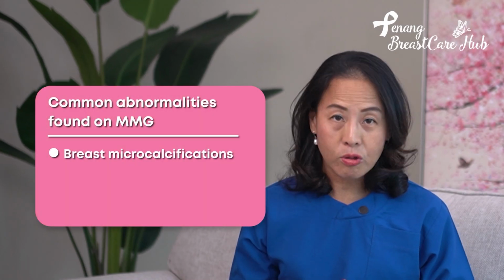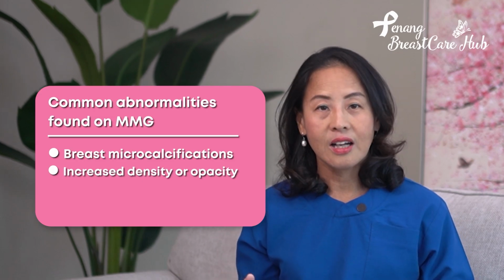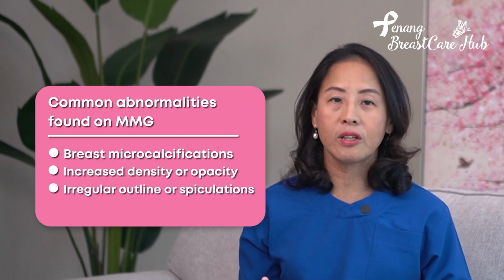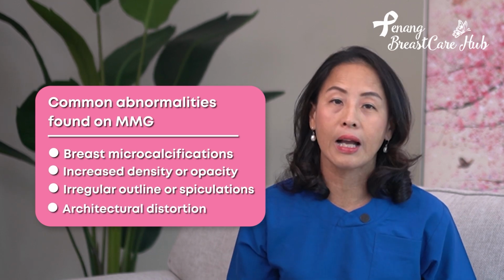There are breast microcalcifications, increased density or opacity, irregular outline or spiculations, and loss of architecture or architectural distortion within the breast parenchymal tissue.